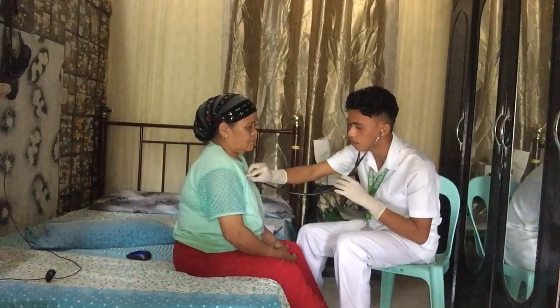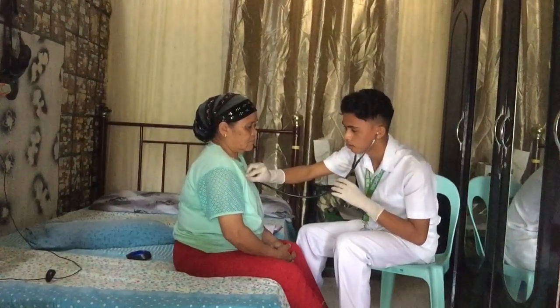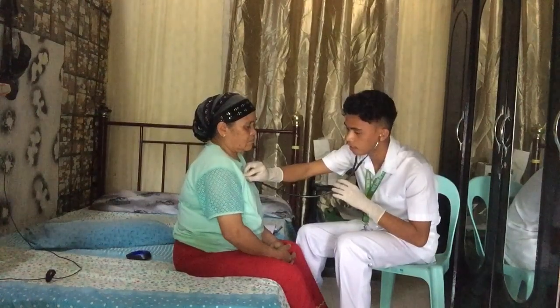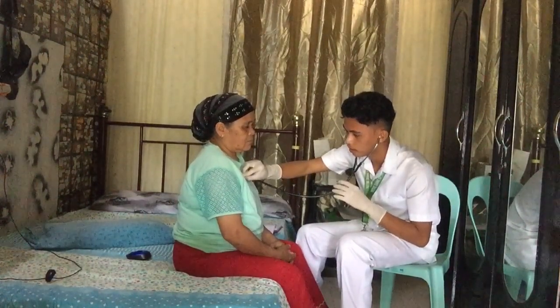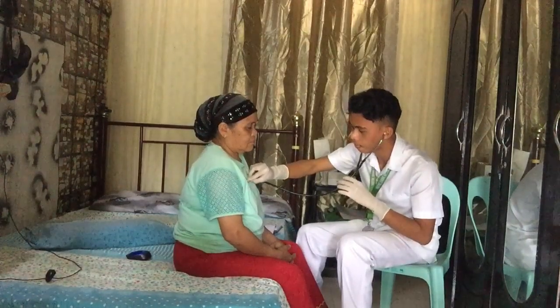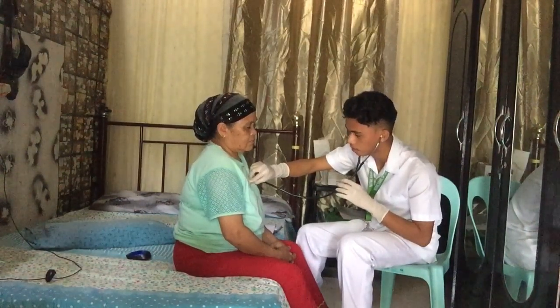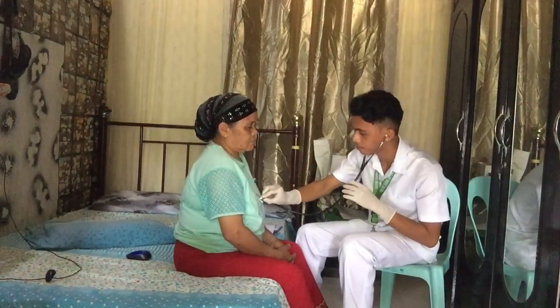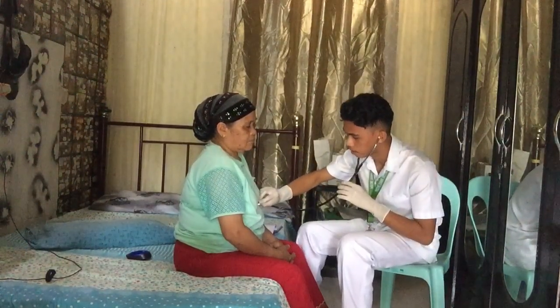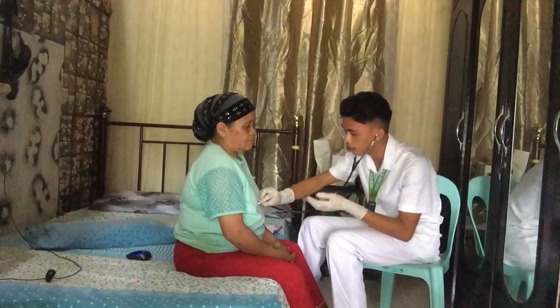Next is going back to the sternum, 2 finger breadths going to the right side, and this is now the aortic. Next is locating the tricuspid. Next is the mitral, just below the nipple.